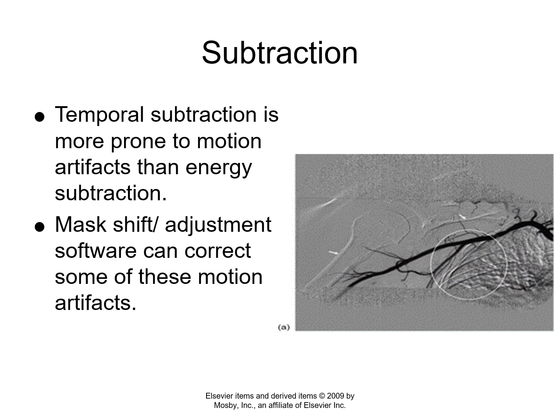Alright, so the software correction that they figured out later, because motion artifacts were so troublesome with temporal subtraction runs, is that they allow you to basically mouse click with the arrow buttons and migrate the mask over to the new position where the patient moved to. And what that does is it basically eliminates those white line artifacts. Okay, and so that's a mask shift, mask adjustment.